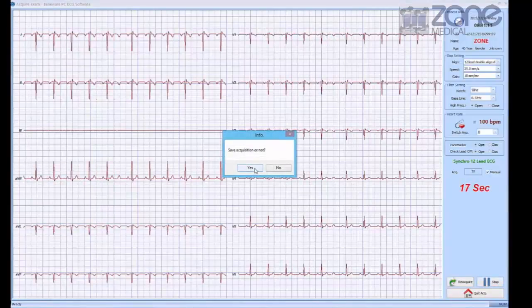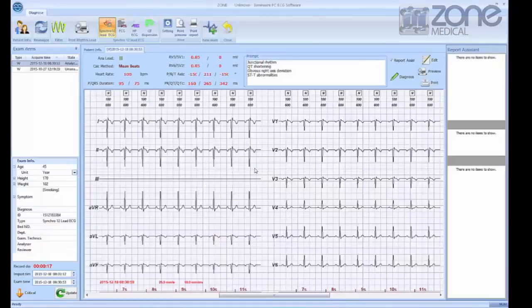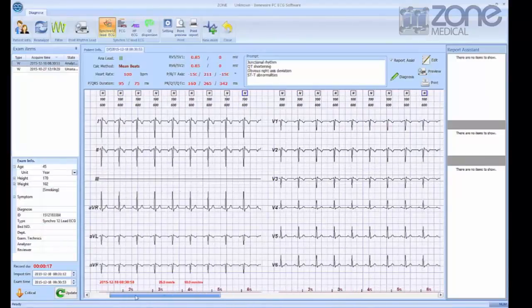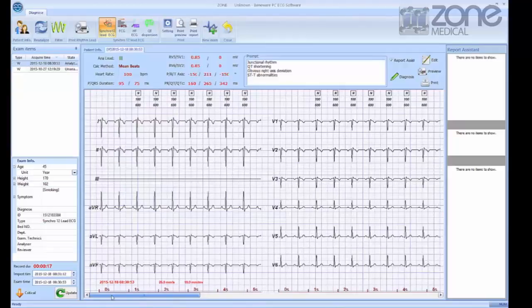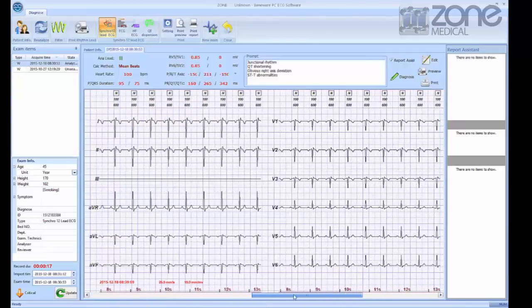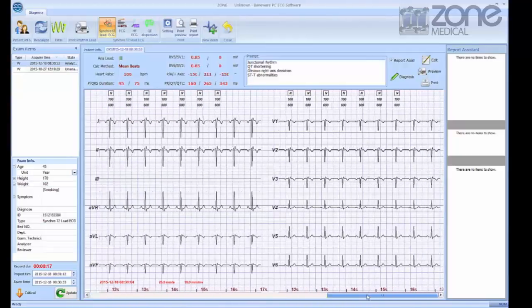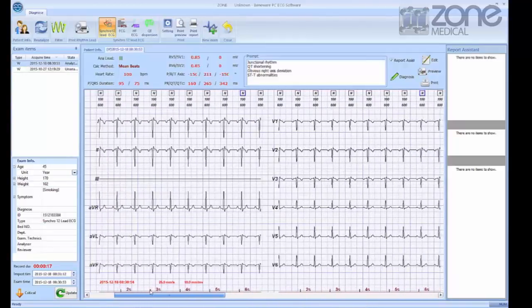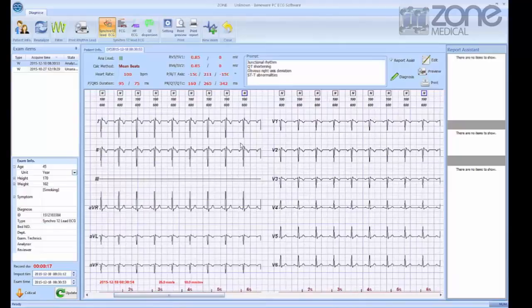You're then taken straight to the results page. In the results, you can see the whole recorded time of the ECG screening and scroll through these. The results will help you acquire a general diagnosis for your patient.